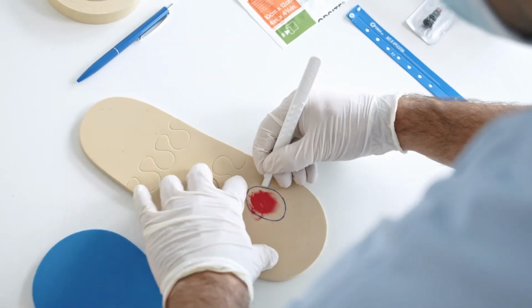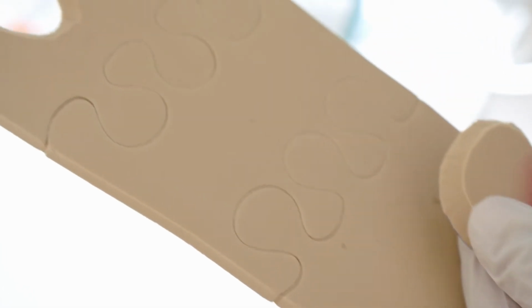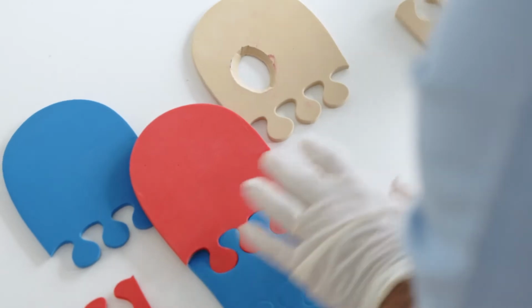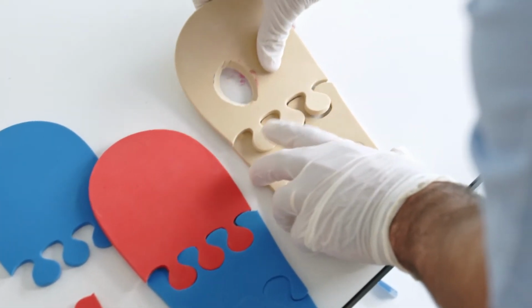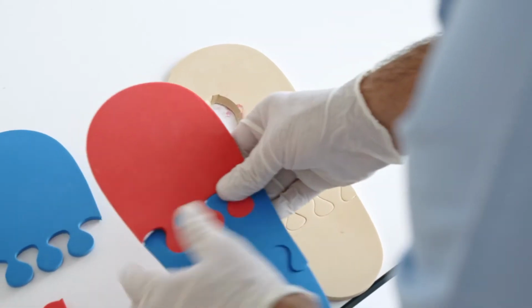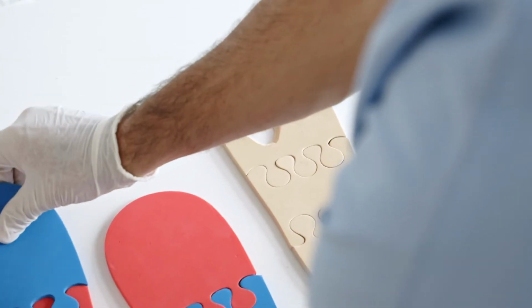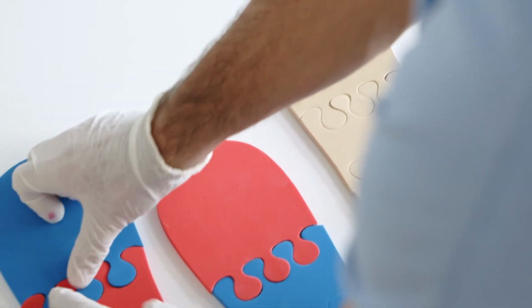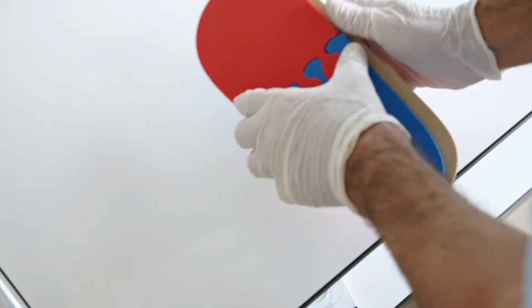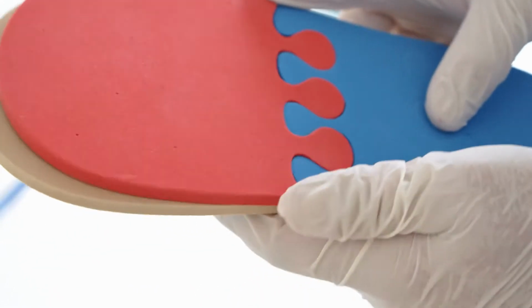There are 3 rules to always bear in mind when it comes to the composition of the kit 3x3. The offloading hole must never be in direct contact with the lesion. The patient's weight is very important. Above 90 kg, the offloading hole must be carved out of the blue layer. Under 90 kg, as in the case of our patient here, the offloading area must be cut out of the beige layer. Finally, only the red layer can be in direct contact with the injury. In this case, it's the forefoot.